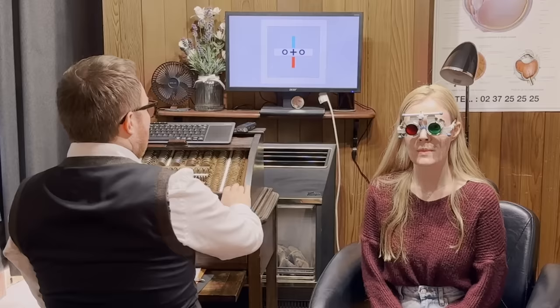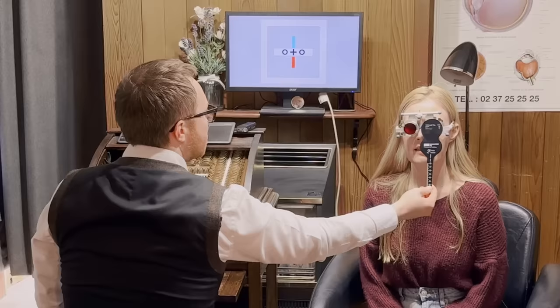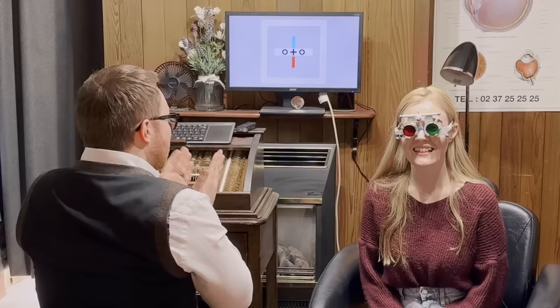Now if I were to cover up one eye, has one of the blocks disappeared? Yes, the bottom one. Yeah. And if I had to cover this line? Yep, the top one's gone. Brilliant. And hopefully, you should be able to see both of them now. Yep. Excellent. So as you're looking at the plus, does it look like those blocks have moved? Are they still perfectly in line with one another? Are they wobbling about? Or? They're in line, I think, yeah.